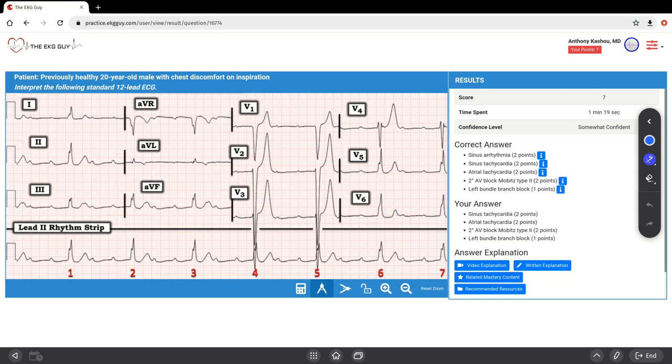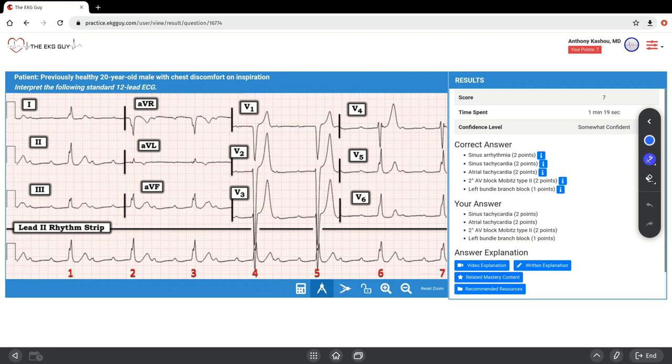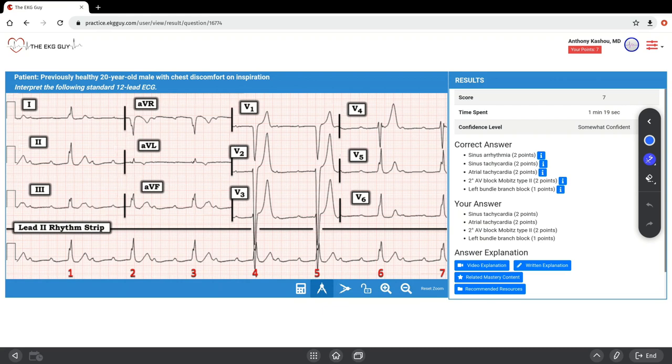Another clue supporting the 3 to 1 AV conduction and on-time atrial activity is the subtle deformation of the terminal portion of some QRS complexes by the hidden P waves. For instance, notice the extra notch at the end of beats number 4 and number 5 in the rhythm strips compared to the other beats. You can see that there in 4 and 5 that we don't see in any of those other beats, supporting that there may also be atrial activity within there.